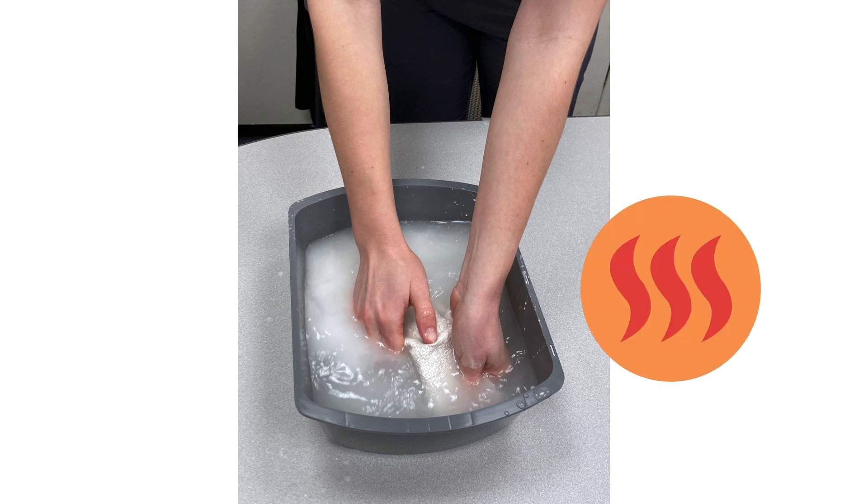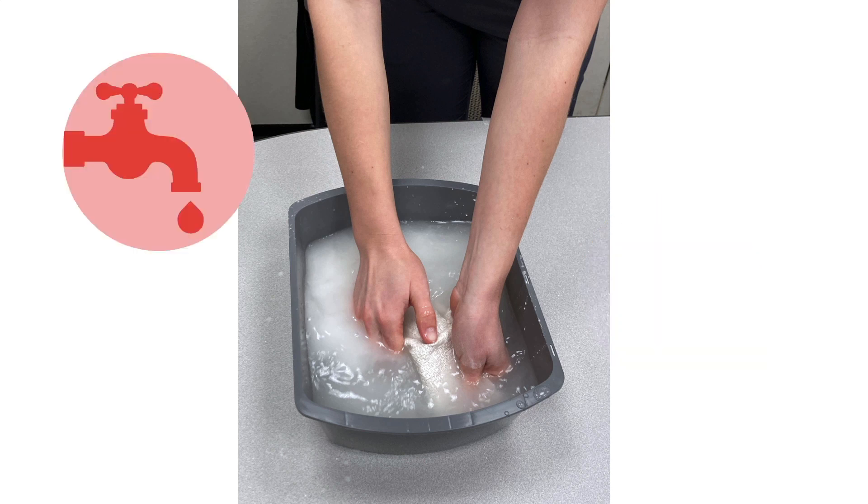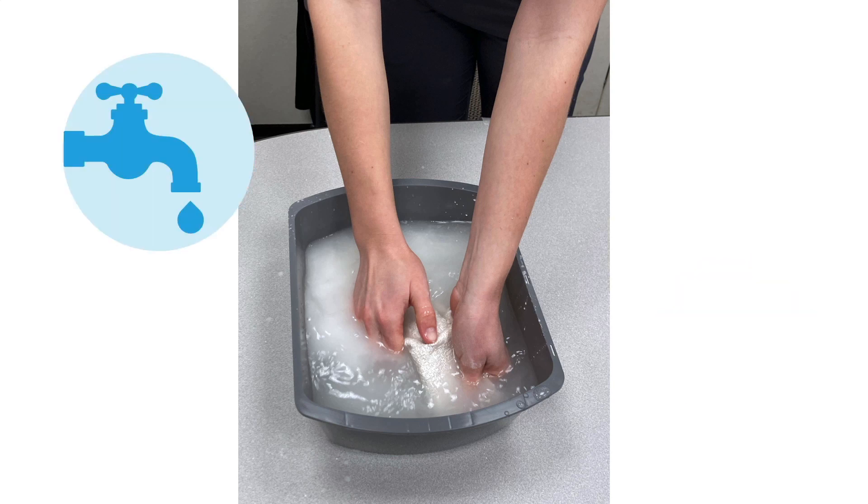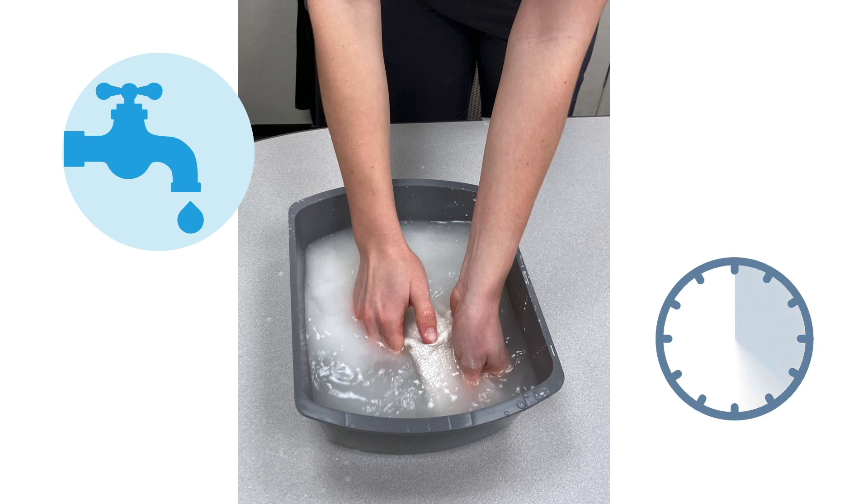This is an exothermic reaction — you'll notice that the material gets warm as it stiffens. You can use warm water if you want the plaster material to harden more quickly. Using cold water will allow more time for the plaster to set.